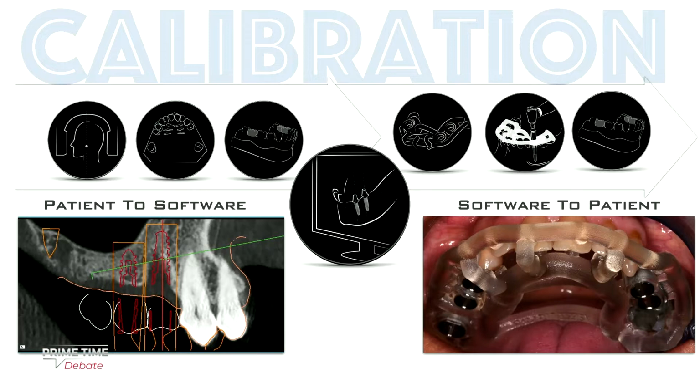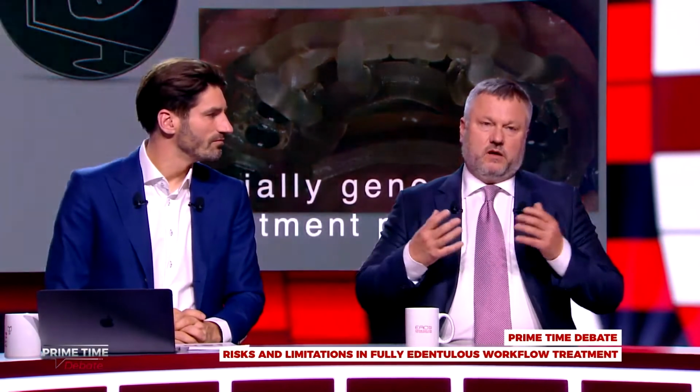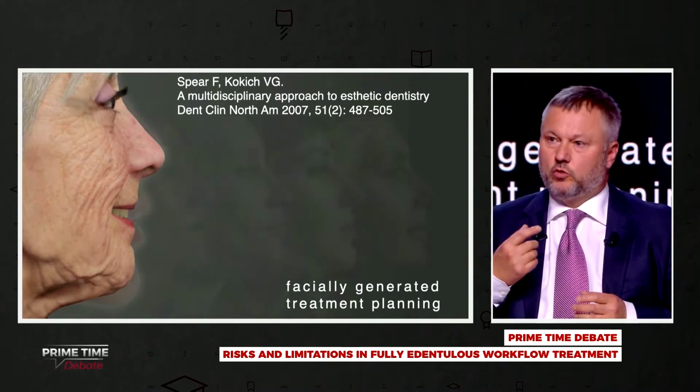But what happens if we don't have teeth, if we're in a full edentulous case? I think we know pretty well now that with good references like teeth, we are on a pretty safe pathway going with a digital workflow, really from A to Z. But for me, when I have an edentulous patient, it's a little bit of a different story. There are other issues here. First, when we are treating an edentulous patient, we are having real influence on the face of the patient, more than when we are doing 1 or 2 implant crowns.